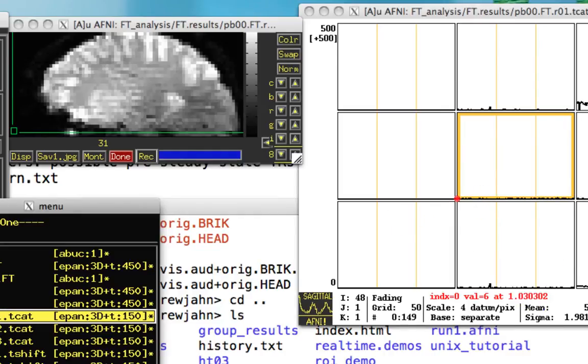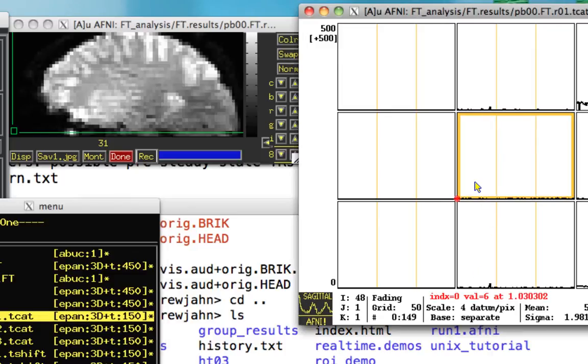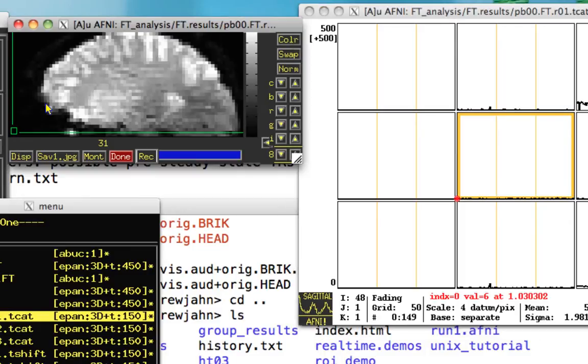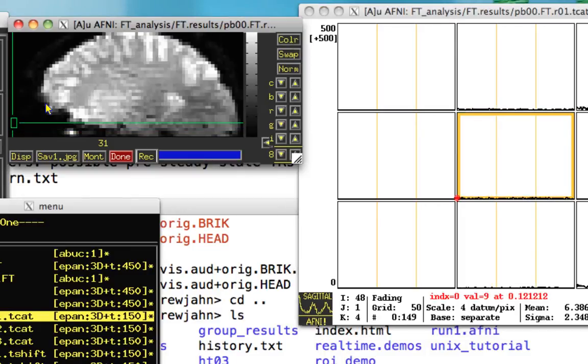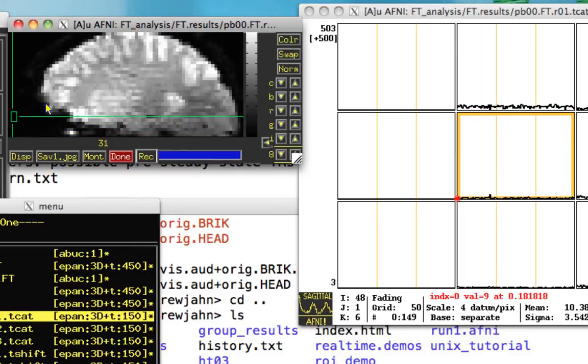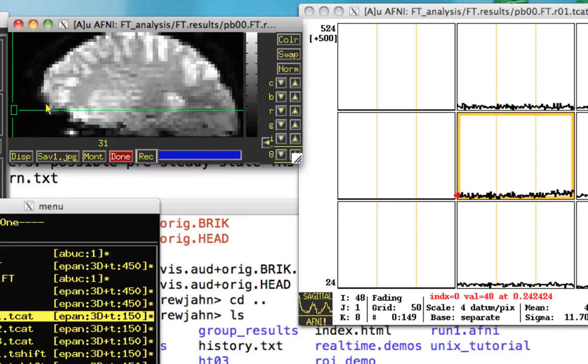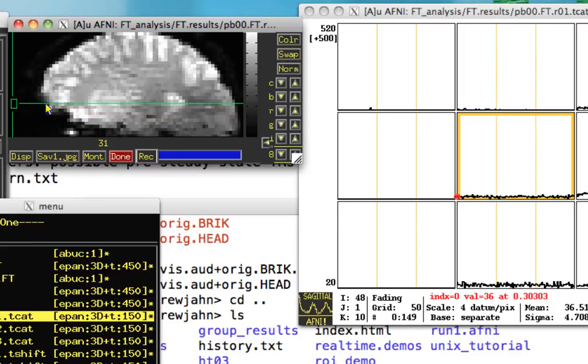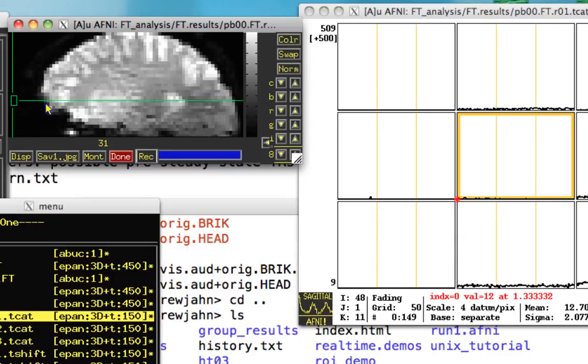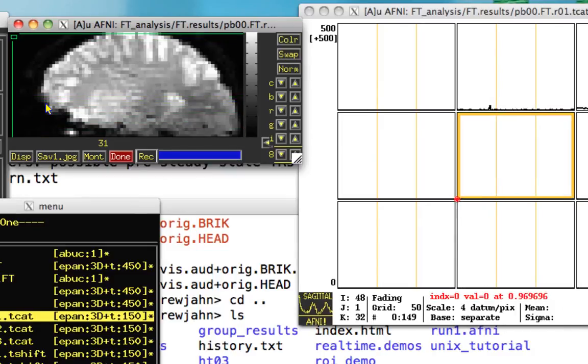If I go up one more slice, I should see 0.061, as I saw in that 3D info command. So I keep going up. And each time I go up, you see the values are interleaved. So we've acquired this slice, then this slice, then this slice, all the way up until the end, then we go all the way back, and we acquire every other slice.